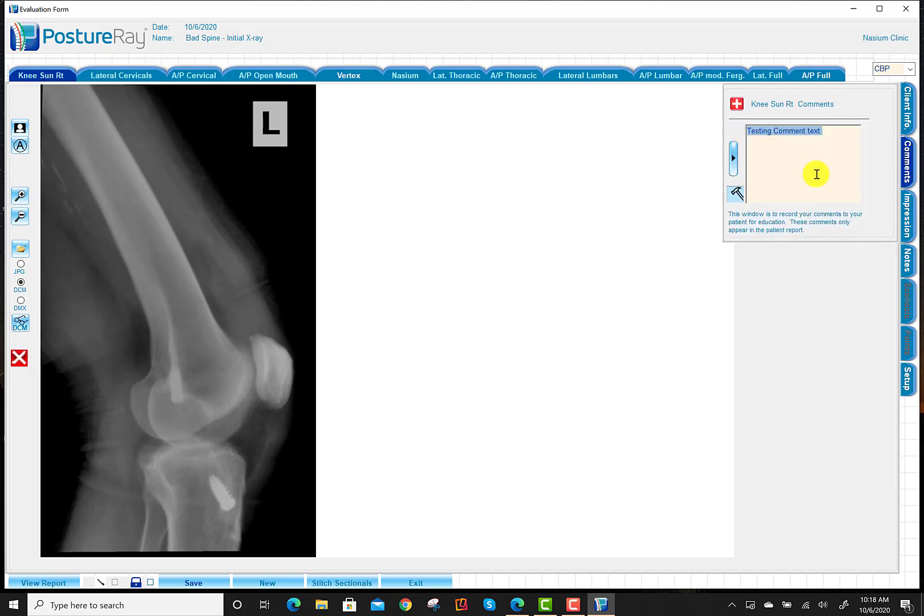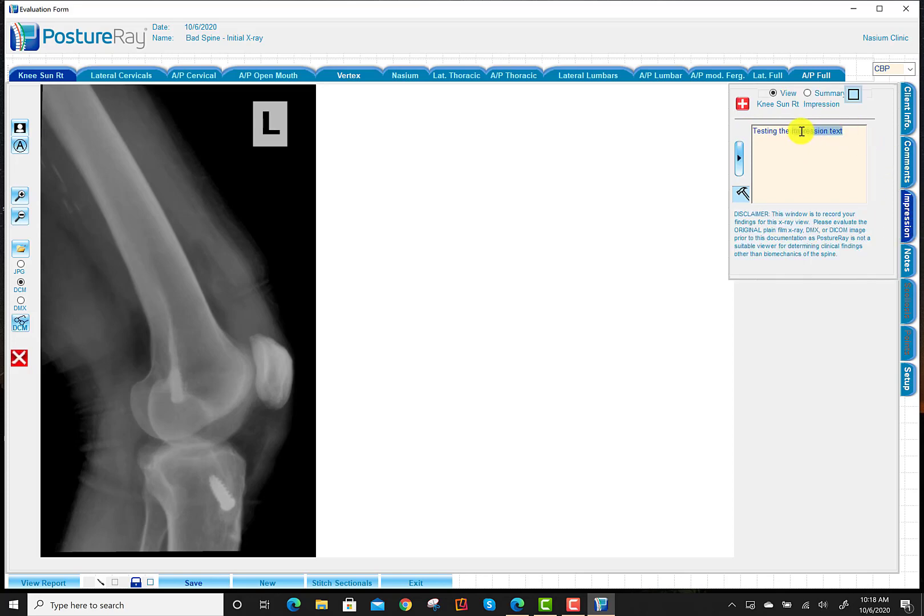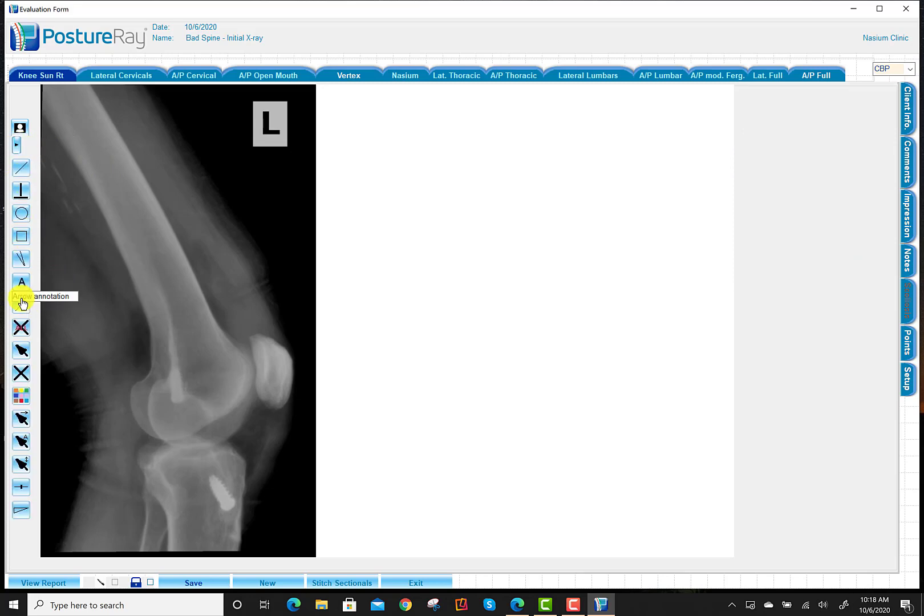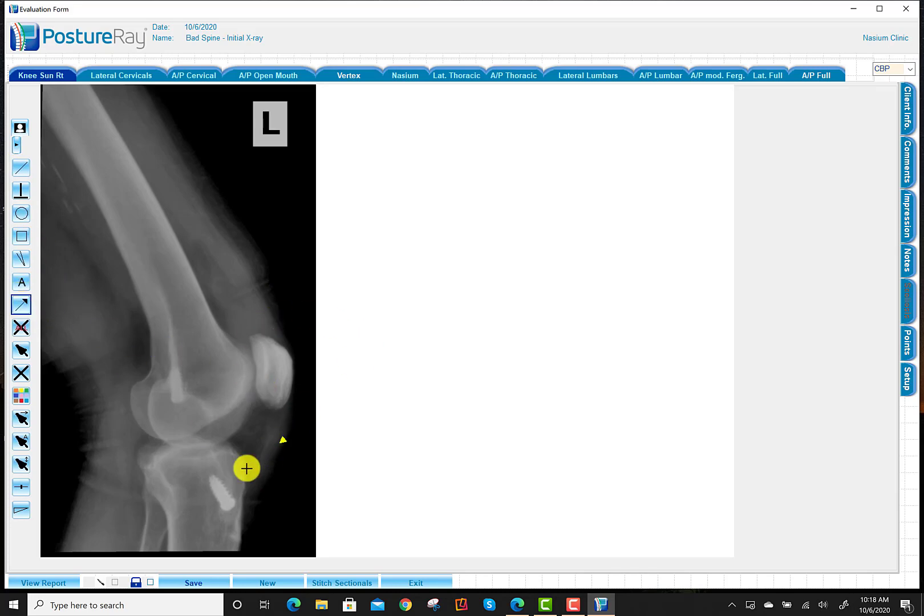While I'm in this view, I just want to bring your attention to that you can still write comments to your patient. I just put testing comment here and also write pathology notes here as well. And you can still use the annotation tools if you wanted to draw, bring attention to certain things. Like if I wanted to bring attention to, say, the screws that are in there. So you can do those things.